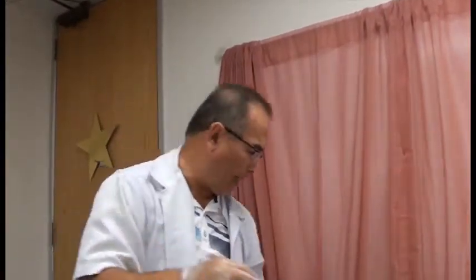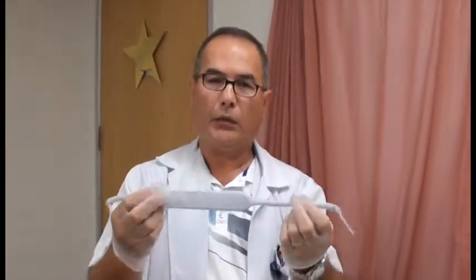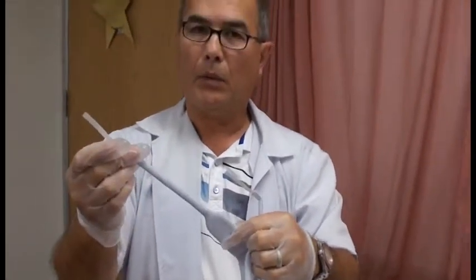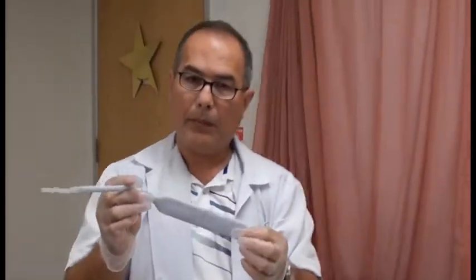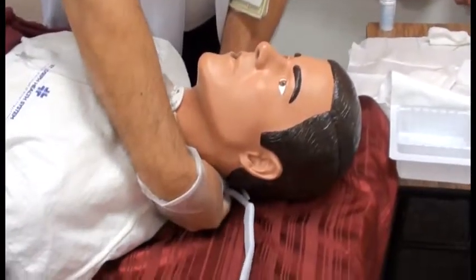We disposed of that, and instead we now have our modern or more comfortable trach ties. As you can see, it has foam and secured by Velcro, and it's much more comfortable for the patient. Okay, so we're going to be replacing the trach tie at this point. So first of all, I'm going to insert the trach tie behind the patient.